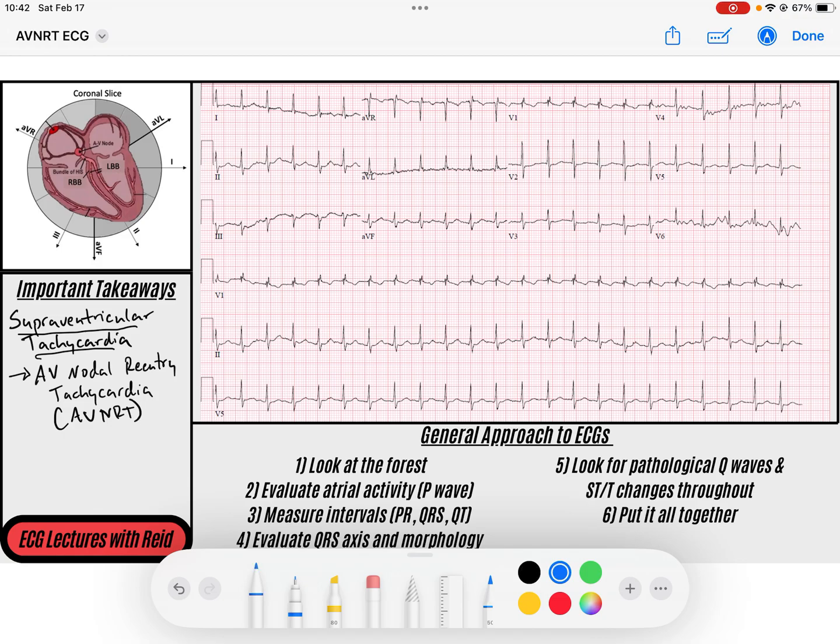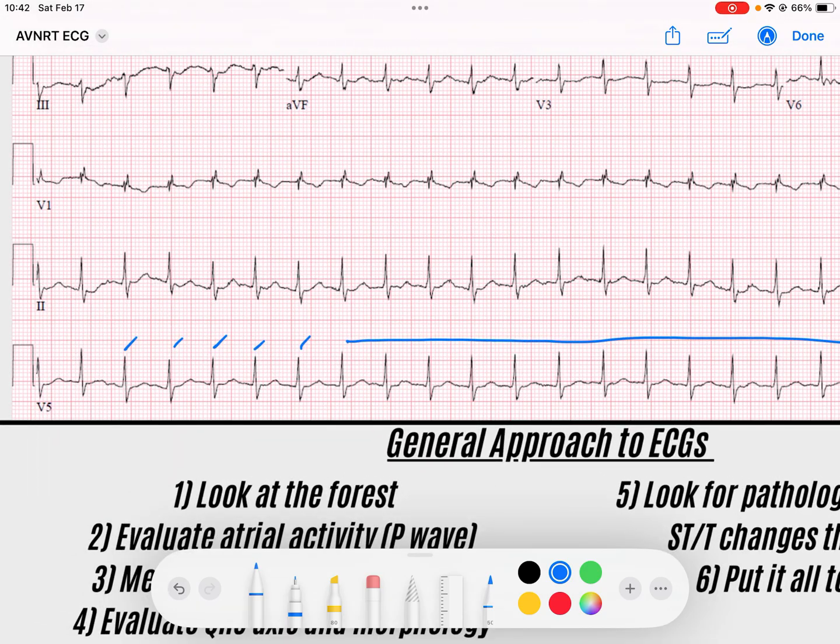AVNRT, AV nodal reentry tachycardia, is a narrow complex supraventricular tachycardia. As you can see here, that is very regular. It is narrow complex as long as there are no ventricular conduction delays and you see that throughout the entirety of the rhythm. You can see if we get the rate here, we have this QRS on this solid line: 300, 150, just under 150, maybe 140 beats per minute.